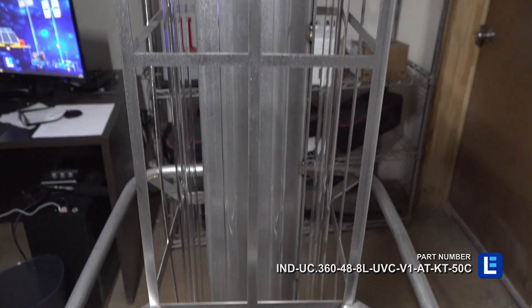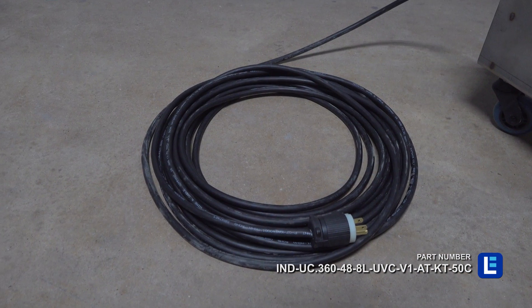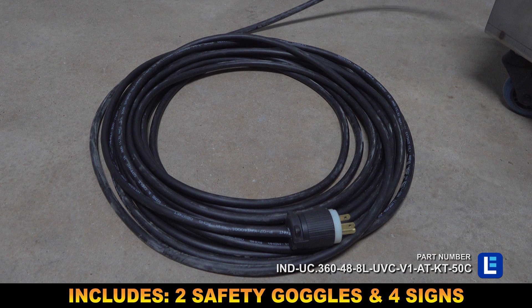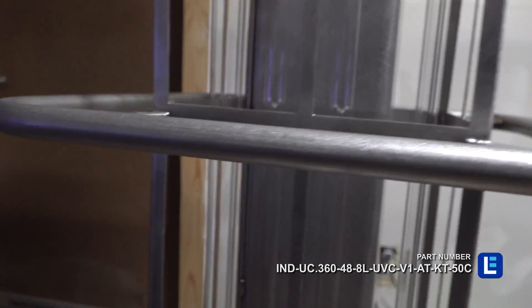Capable of disinfecting an entire room, the 304 stainless steel UV system comes with 50 feet of 16-3 SOOW cord and a safety kit that includes 2 goggles and 4 safety signs. This UV sanitation cart is a powerful sanitation solution for industrial sites and commercial facilities.